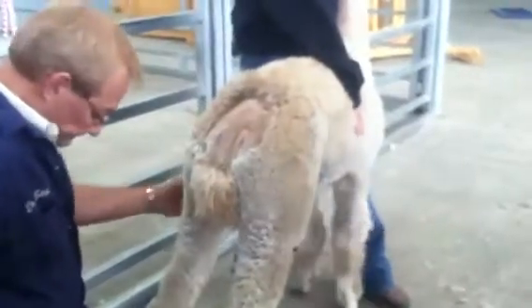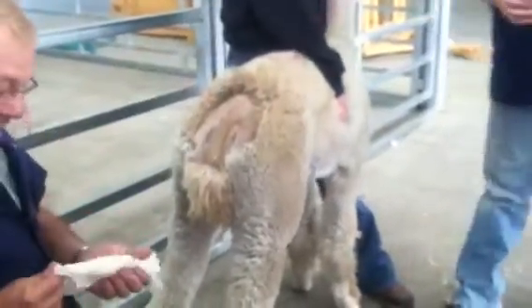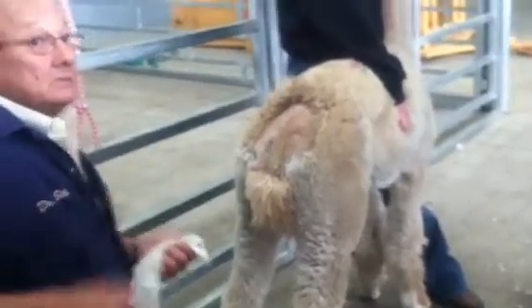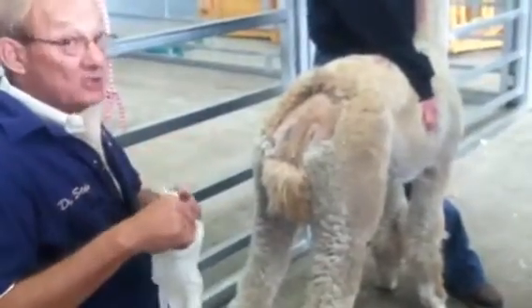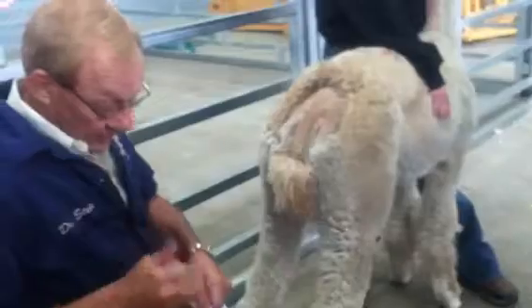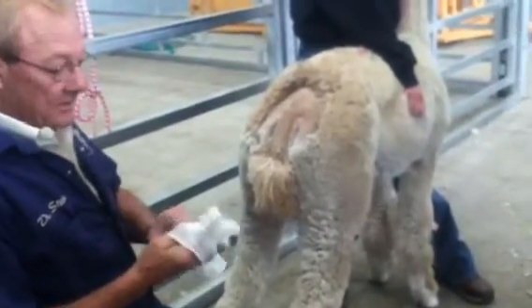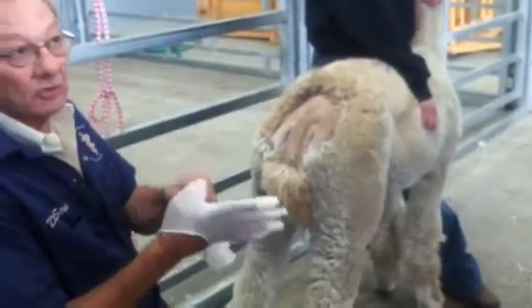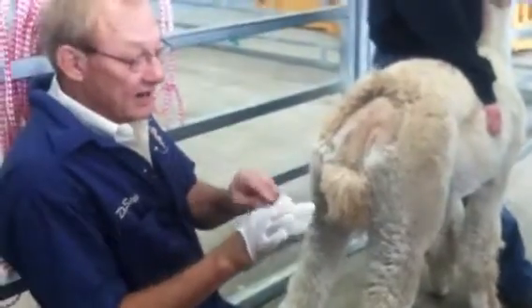Can you give me a pair of gloves? You notice how nice and sterile I am? When I'm doing livestock, I generally just wash my hands — I don't do a full surgical scrub. Because we're lucky enough to keep the animal inside a squeeze chute or something for ten minutes before they go completely crazy. So what you've got to do is plan ahead.